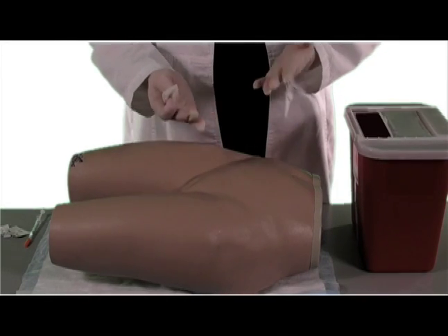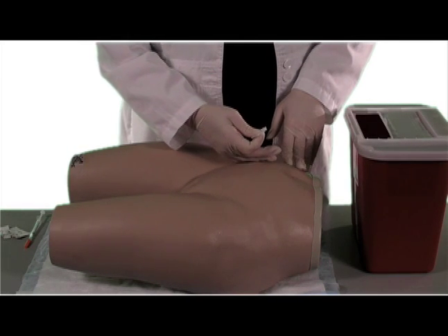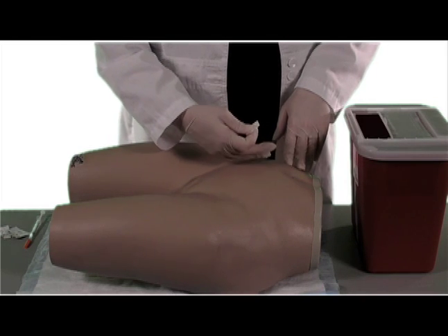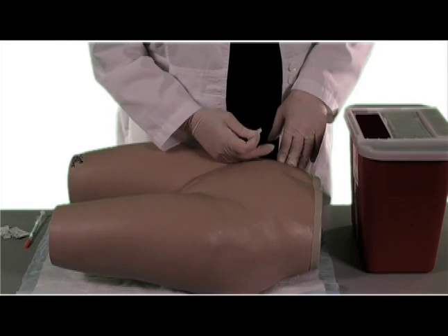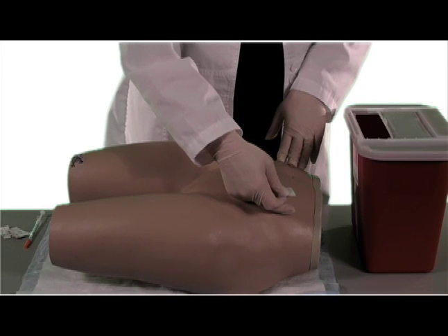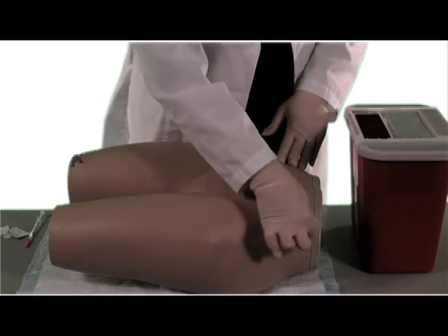Here we are at the patient. We have our clean gloves on. We have our alcohol pad. Remember, find out which side the previous injection was given on. In this case, we're going to give it on the patient's left side. You want to make sure you're about two inches away from the umbilicus. Find your spot, put your alcohol right there, and go in a circular motion — three to five seconds to cleanse the area.